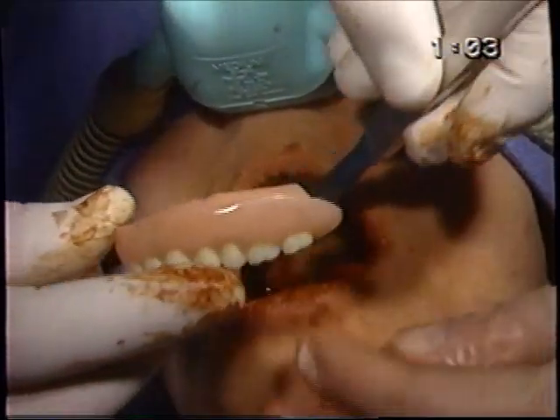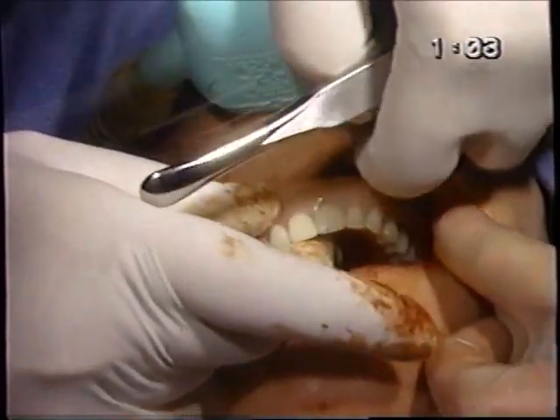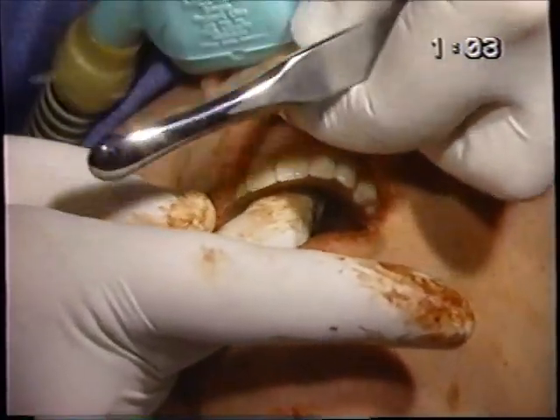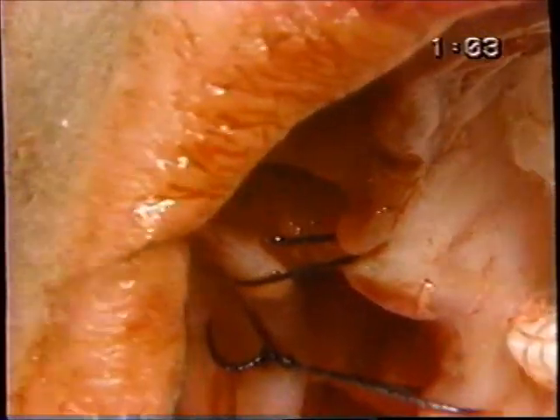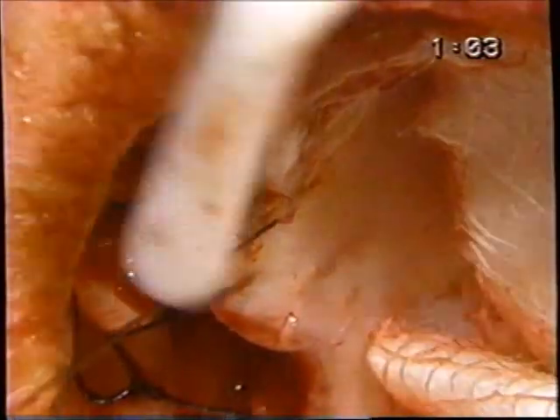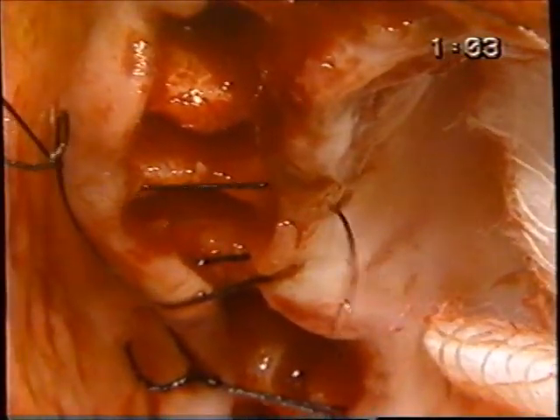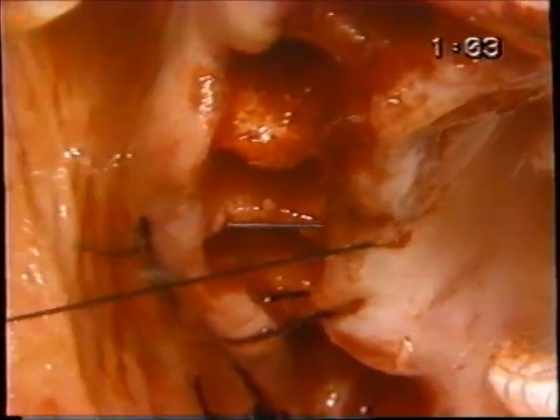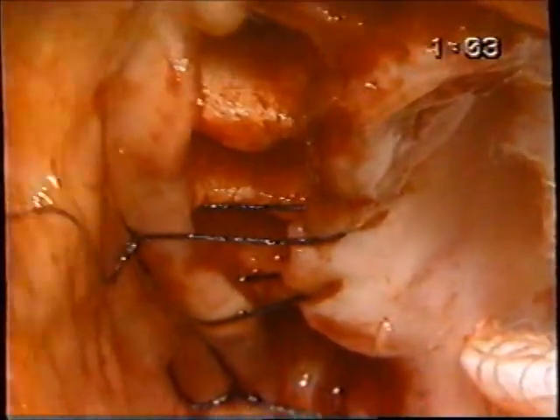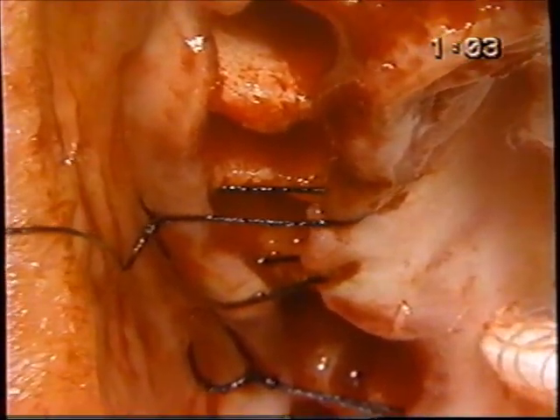Okay, open now. Now that we've completed removing any granulation tissue either at the base of the socket or near the papillae or inflamed papillae, we've done the bone smoothing with the rongeur and also the bone file. Now we're suturing with continuous lock sutures. It's certainly quicker than interrupted. We don't want to have it so tight that it blanches the tissue.